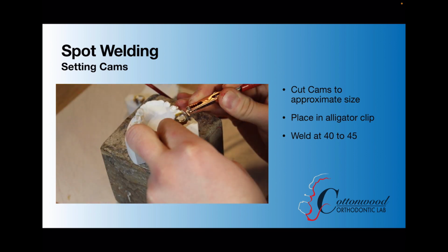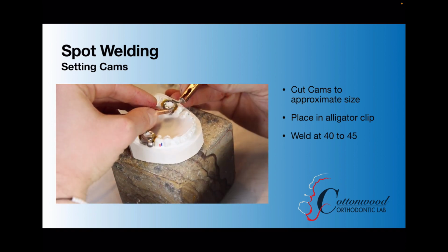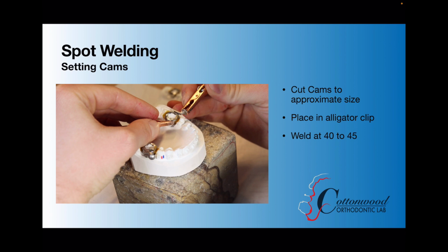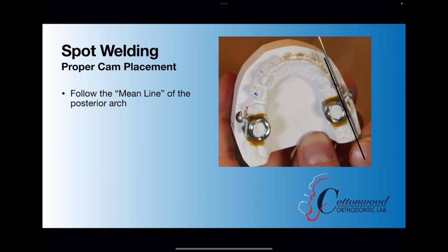Now, one of the biggest tricks is sometimes this is an appliance you have to come back and do small adjustments on. You're not always going to get it right the first time. But one of the indicators you can use to help make sure you're getting your proper cam placement is by drawing or seeing that median line down the posterior cusps and aligning that cam. You can see we're using the foot of that cam to be parallel with that, okay?